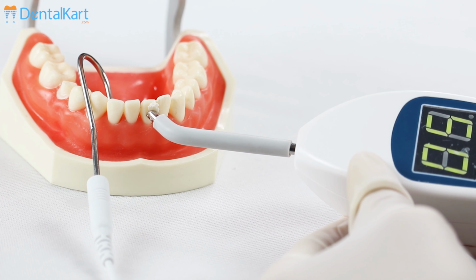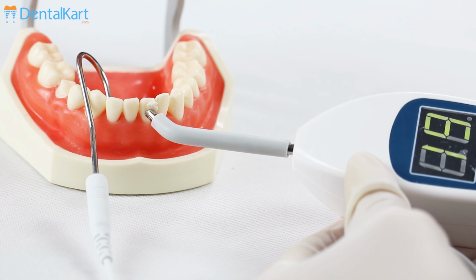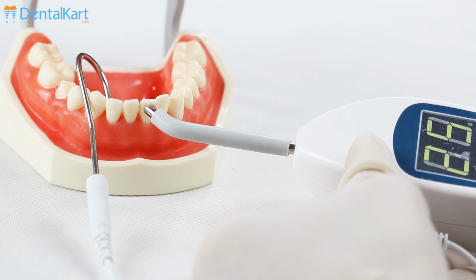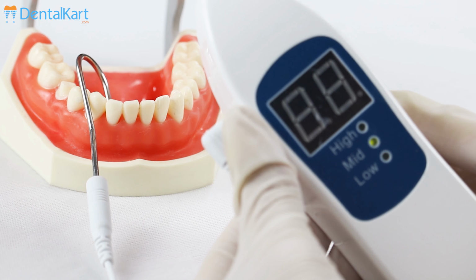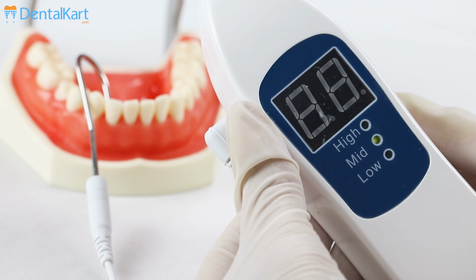Ask the patient to tell when they start feeling the toothache or tingling sensation by raising their hand, and stop immediately to record the reading displayed on the screen, as this figure is the tooth stimulation current reaction number.